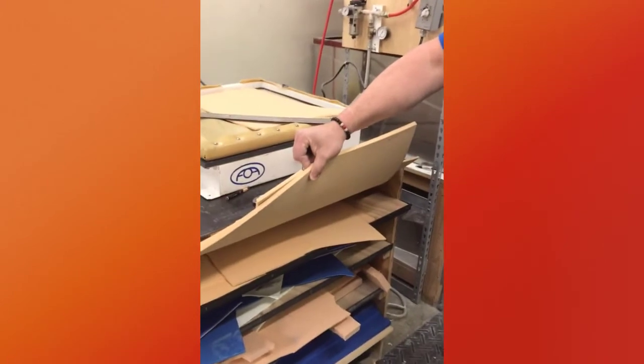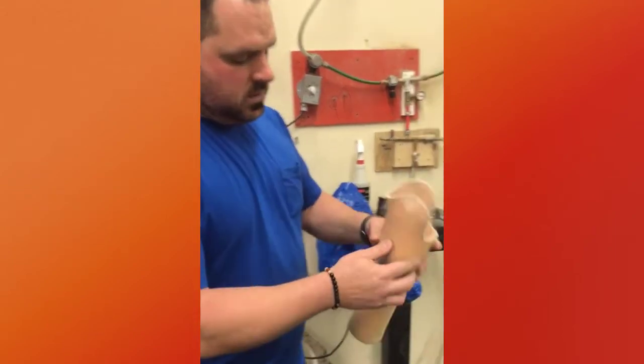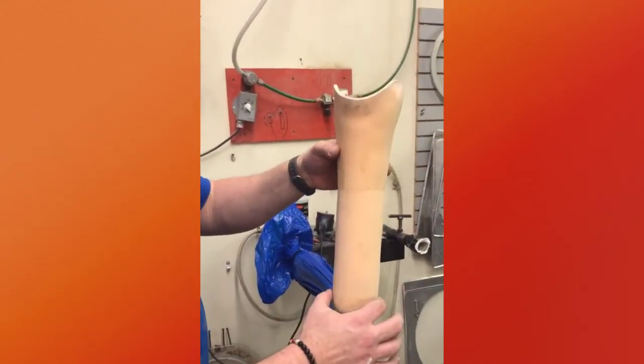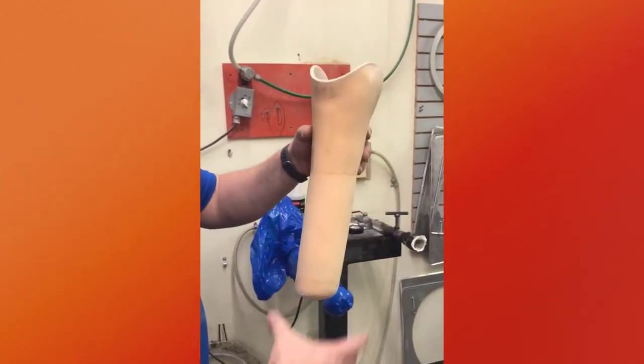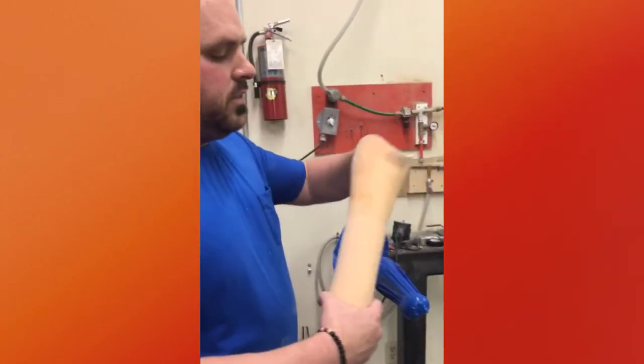We take some thicker pieces and we wrap that around, so that when it's done we've got the same circumference from here to here — so it creates a stovepipe, and it won't lock them in the socket.